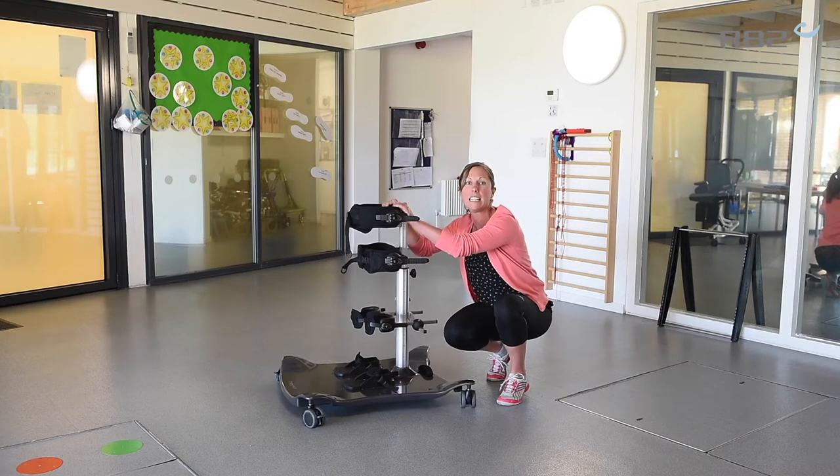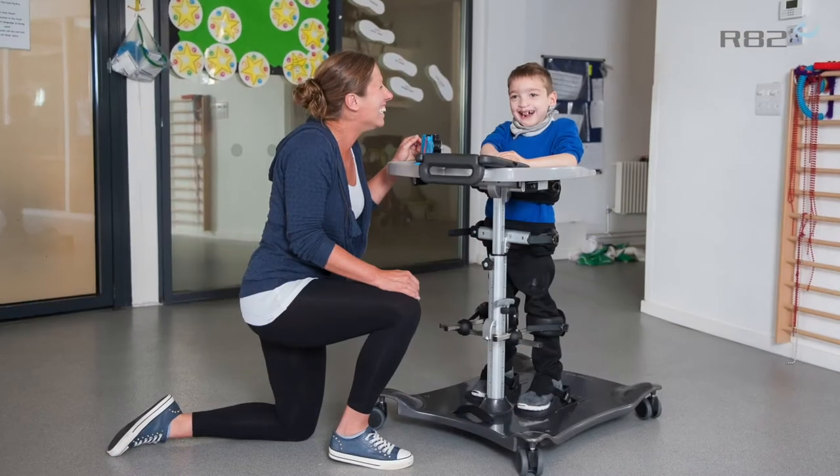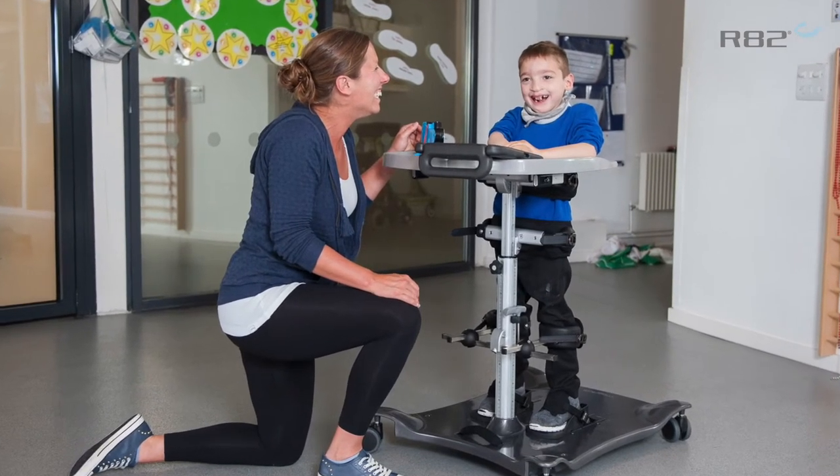So with that, in anterior you've got this firm support but you've also got a lot of the support at the front of the meerkat perhaps getting in the way of the child accessing a table, for example. So you do have the use of the tray.